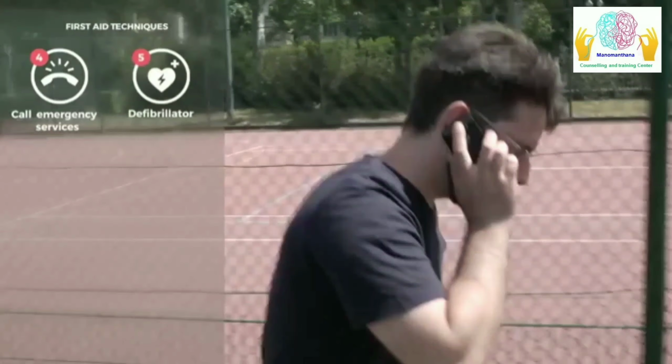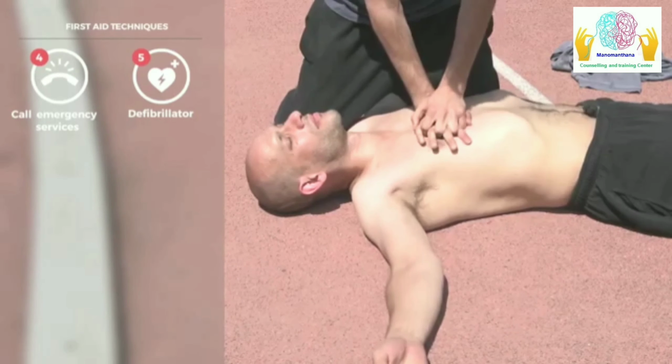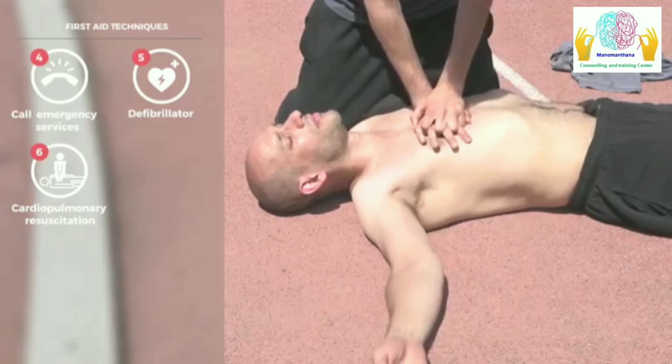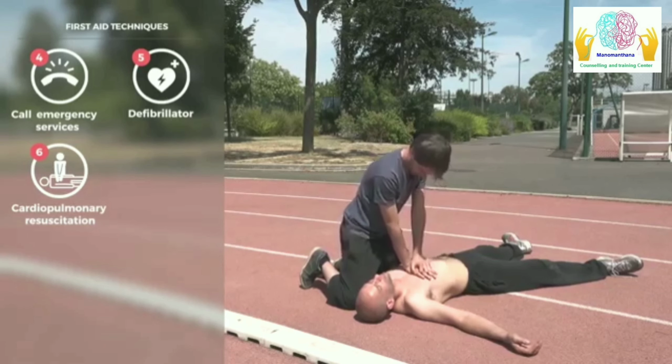Ask someone else present at the scene to bring a defibrillator. While awaiting the emergency services, expose the casualty's chest and begin chest compressions by pressing down on the center of their chest at a rate of 2 per second. If you're alone, do not perform any chest compressions, but go and find a defibrillator if there is one nearby.